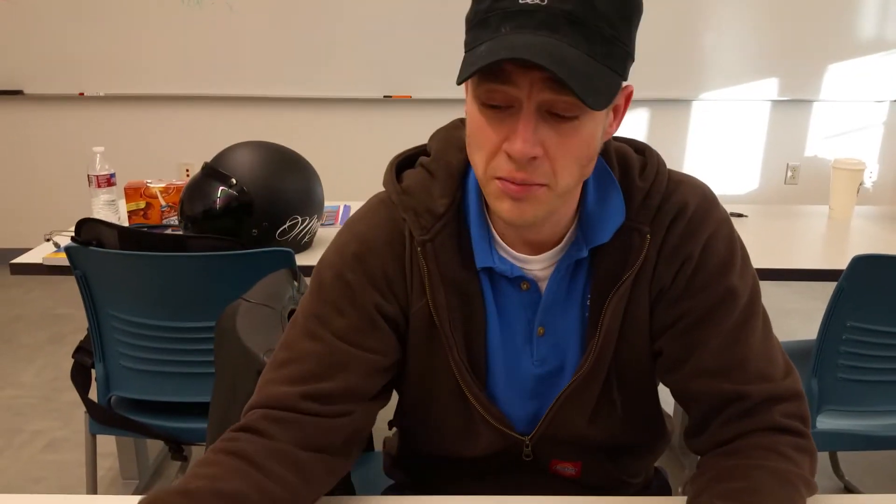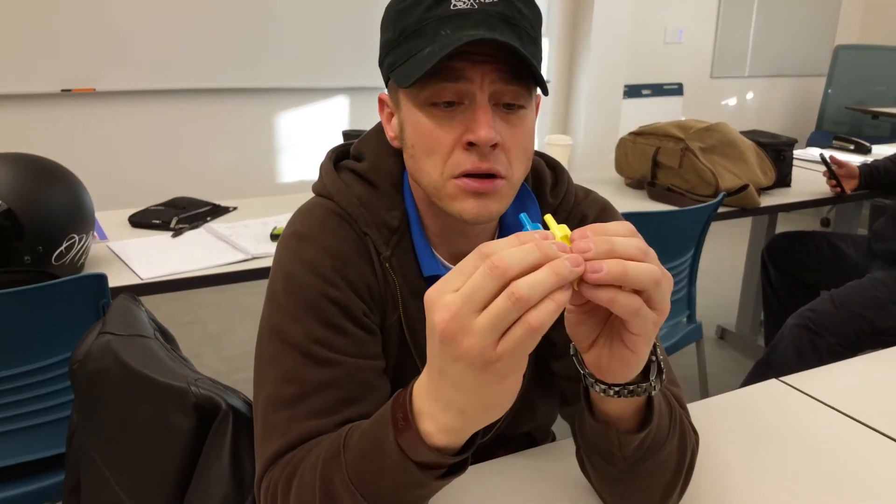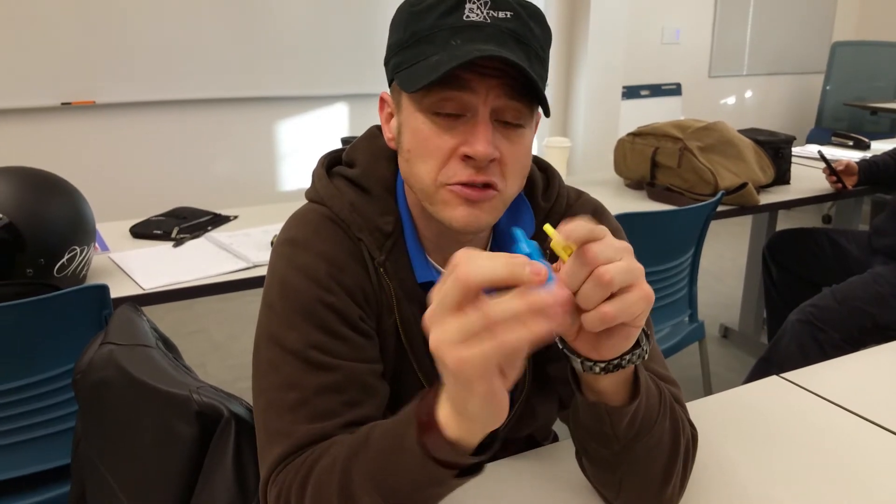This is the Venturi mask. It is for when a physician orders fixed FiO2 at very specific numbers. They're written on here: 4 liters per minute at 24%, and you have to follow both.